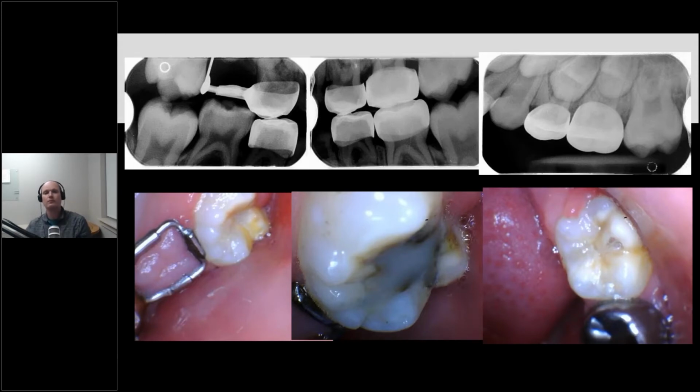But the question is, does Biodentine seal the interface to dentin? No gap. Correct. If you look at some of these calcium silicates that are out there, they actually penetrate the dentin tubules, similar to the SDF product that I was showing you earlier. And the microscopy is amazing. I'll add that video into the hands-on one.